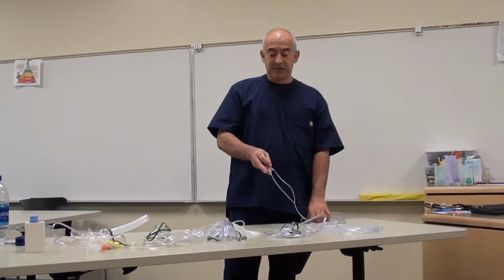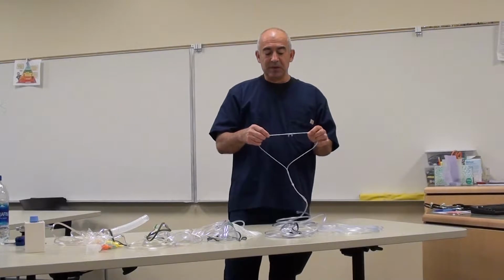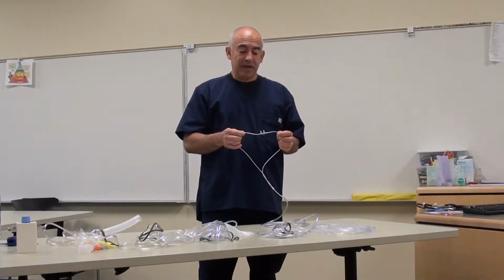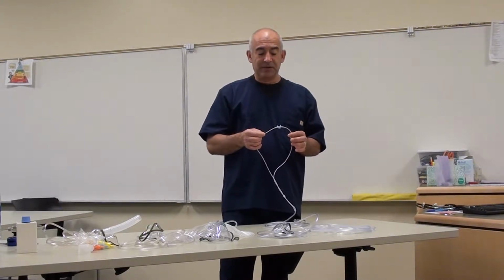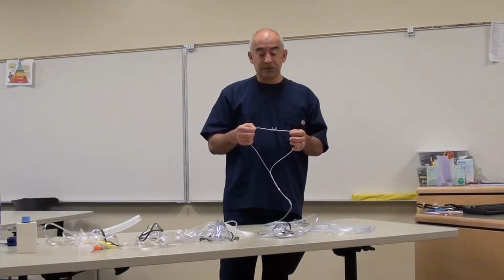The advantages of this device are that it's easy to use, disposable, inexpensive, and you can eat while wearing it. The disadvantage of this particular device is that it can be irritating to the nasal passages for some patients, especially at the higher flow rates, and it can be unstable and dislodged.